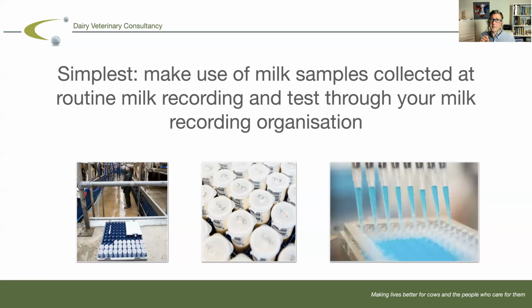One advantage of using milk samples for pregnancy testing, which makes it simpler than when you're taking milk samples for milk composition sampling, is that you don't need to take a composite sample. In other words, you can just take the milk from one individual quarter and that's okay. It doesn't matter whether that milk is fore milk, mid-flow milk or end of milking milk.